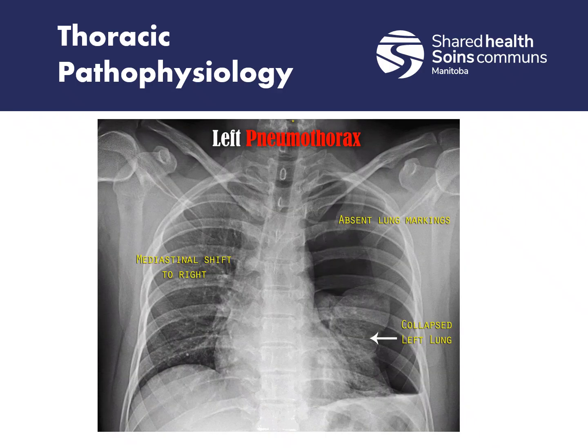For example, here's a chest x-ray. When we look at this, it shows a massive left pneumothorax. At the bottom there, they've got that little collapsed left lung when you compare it to the right, and it's causing some shifting of the mediastinum as well. That's not great. So this person's got a date with the chest tube.